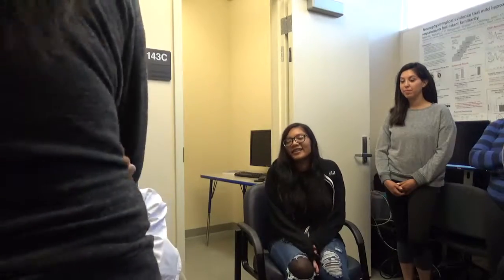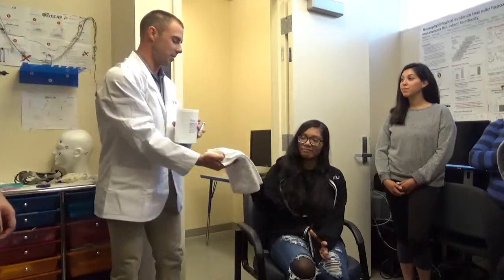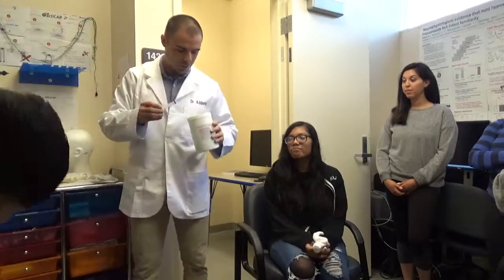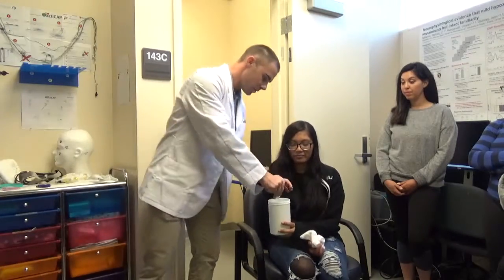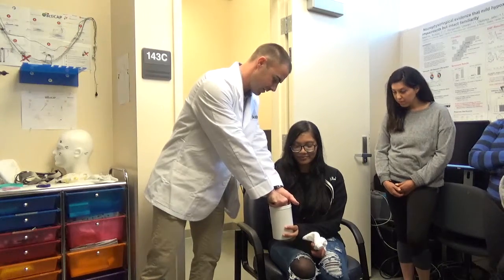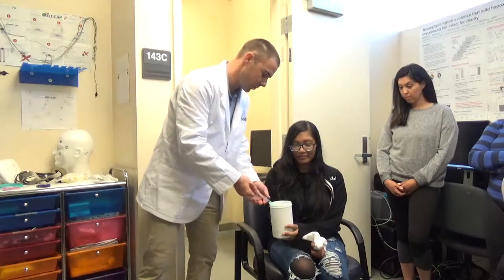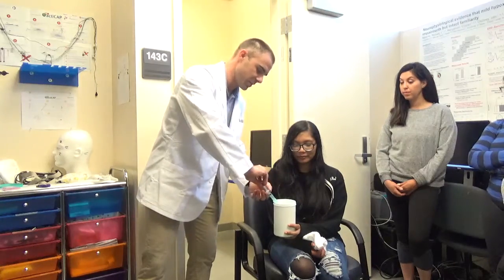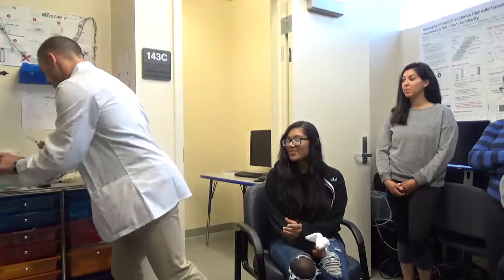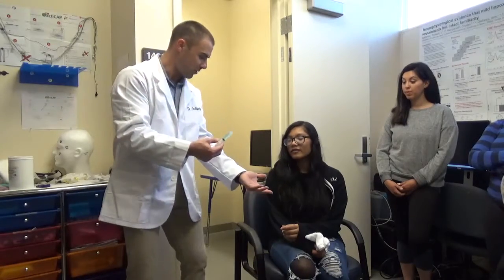Along those lines, we kid because you can do that, but we actually have some. Excuse me. You can give them some rags and napkins and things like that. So she can hold that if you want. But what we would do, can you hold that for me? So you can come in here and actually, wow, this is really in there. Because there's not a lot of gel left in this container, we got to get in there pretty good, so you get a big goop of gel. Which is another reason why we have these lab coats, because that big goop of gel can get kind of messy. So you can borrow that for a second, just in case it doesn't get on your clothes.